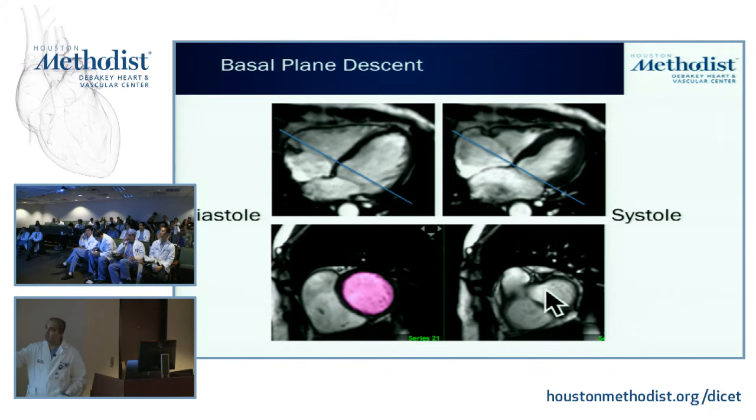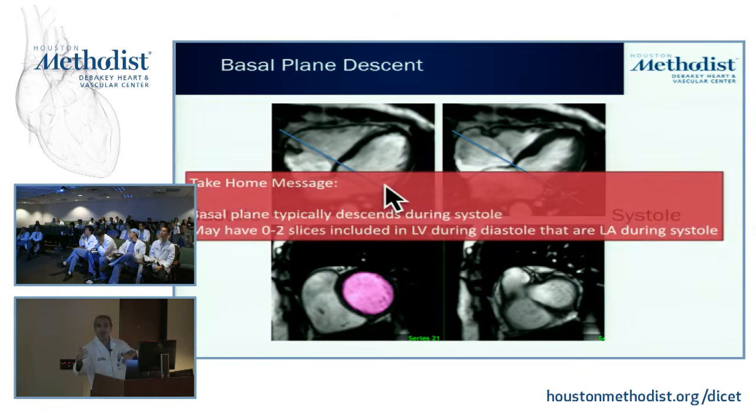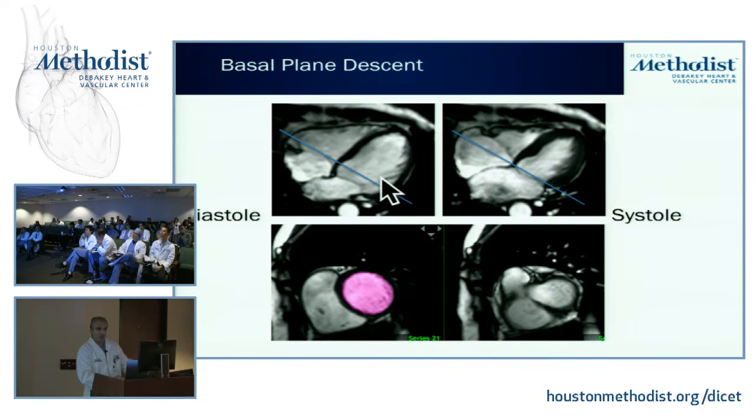So that line, yeah. The way it works is there's two ways you can do it. You can actually have it represent right here the middle of the slice, or some post-processing tools will actually allow you to have 2 lines, which will tell you where the top of the slice is, where the bottom of the slice is. And essentially what I'm going to do is say, okay, is this slice right here underneath the mitral annulus, or is it above the mitral annulus?